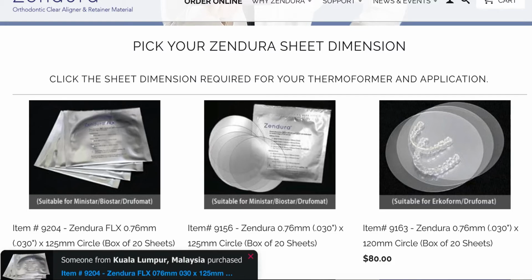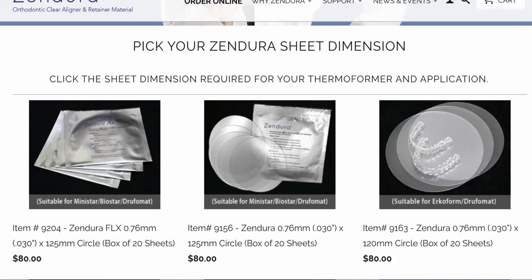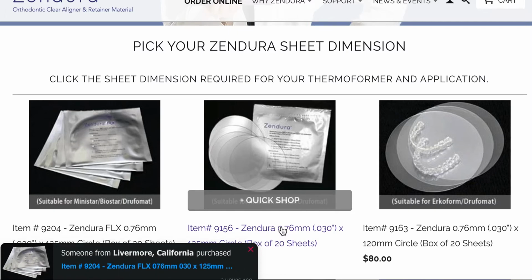So I'm on the Zendura homepage just because that's my favorite brand at the moment. I've been really impressed by the clarity, the properties, the wear. They have two main products just to let you know. There's the regular Zendura, and there's Zendura FLX or Zendura Flex. So this is Zendura Flex, this is regular Zendura, okay? So when you're picking your retainer material to fabricate it, your thermoforming plastic, of course you've got to decide what brand you want to use. You've got Invisacryl, you've got Essix brand, you've got Zendura brand, there's a ton of other ones, Proform. They're all FDA approved, right?